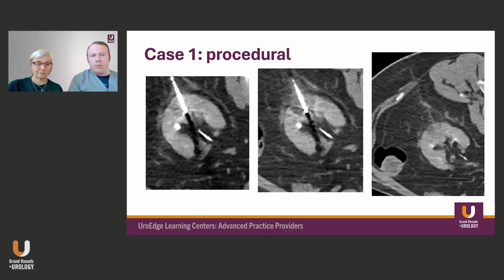So in the left image, we can see the cryoablation probe going right through the mass, which is what we want to do. And in the middle image, we see the actual ice forming, the hypoattenuating mass right here that we're going after. So we see fluid all the time on CT. It looks kind of dark. It's darker than soft tissue, but certainly not as dark as air. And because ice is still fluid, but in a frozen state, it shows up as fluid attenuation.